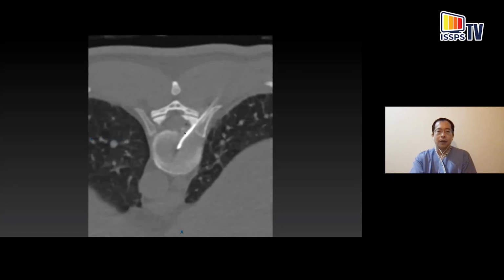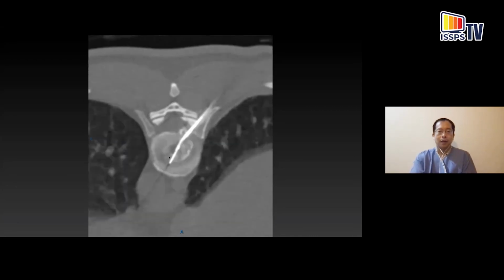And as we went anteriorly, at the level of the facets and the ribs, you start to get the thoracic intervertebral disc space. That's how we entered into the intervertebral disc space in the midline. And that is the RF cannula extending with a clear margin of safety away from the thecal sac. And that's a little bit of our epidural injection that we use to push the spinal cord slightly away from the needle path.